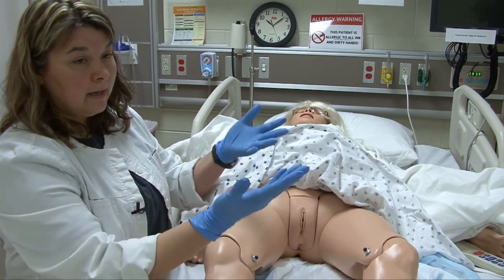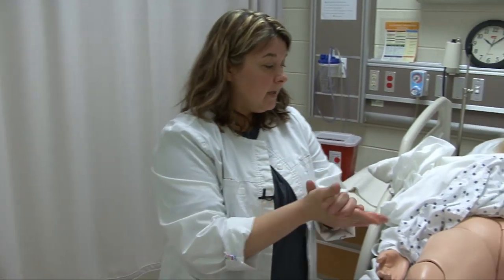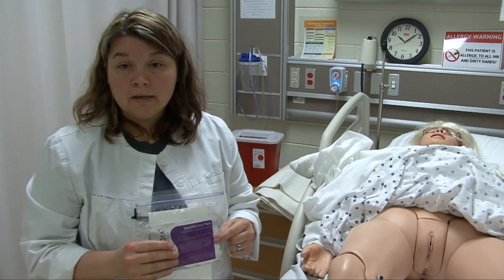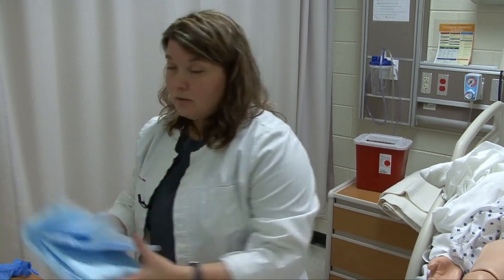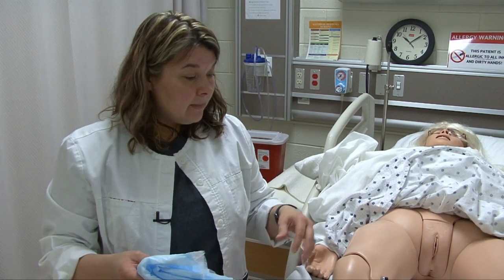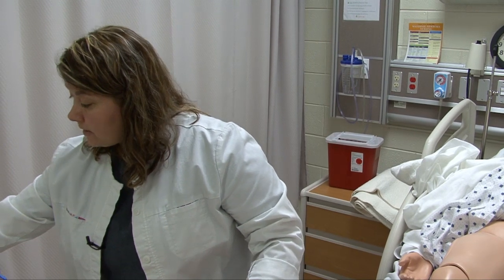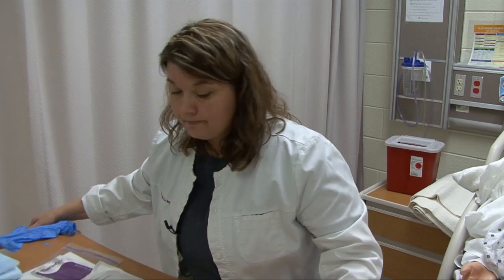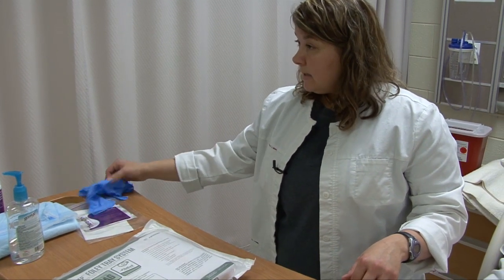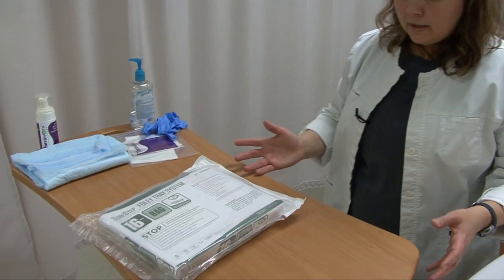I've now cleaned my patient, so I can take off these gloves and foam again. I'm going to explain to Mrs. Smith that I'm now to the part of the procedure where I'm ready to open up and become sterile. I'm going to save the other TheraWorks wipe to use when I'm done. As always with sterile procedures, my table needs to be at least waist height. I need to make sure the table is clean and dry, that I'm not talking over my field or reaching over it. Examine equipment to make sure it's clean, dry, intact, and within the expiration date.